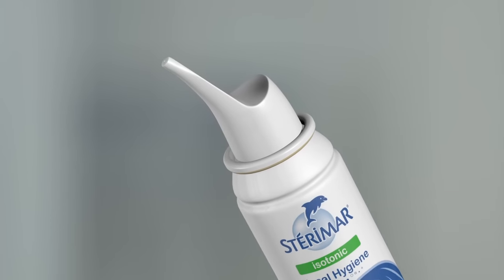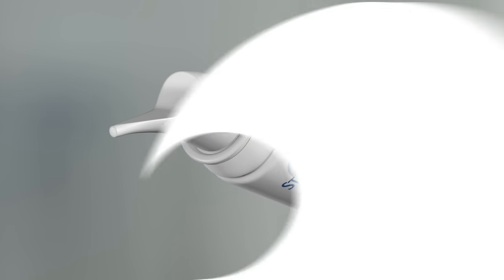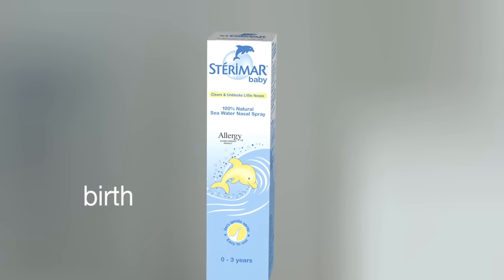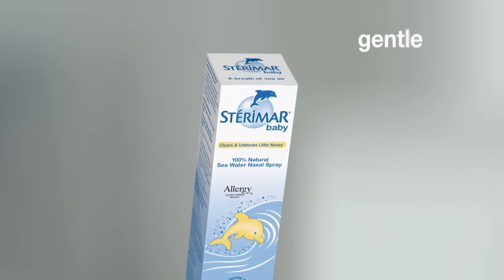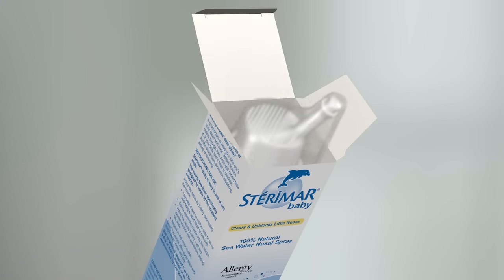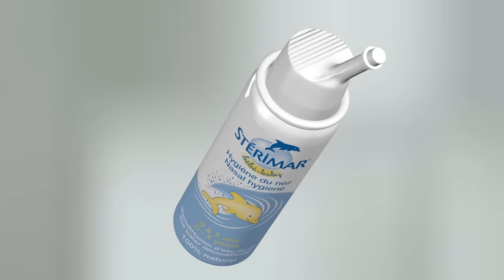Make sure that you thoroughly rinse and dry the nozzle before placing it back on the can. Cleaning the nozzle is especially important if you share Steromar with other members of your family. Steromar also offers a spray which can be used from birth to gently unblock little noses and wash away germ-filled mucus. Steromar Baby can be used at any angle and has a nozzle specifically designed for delicate noses.